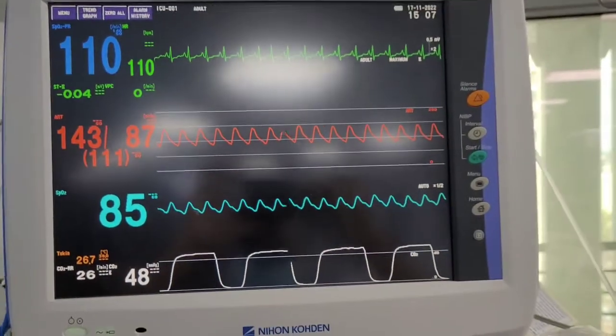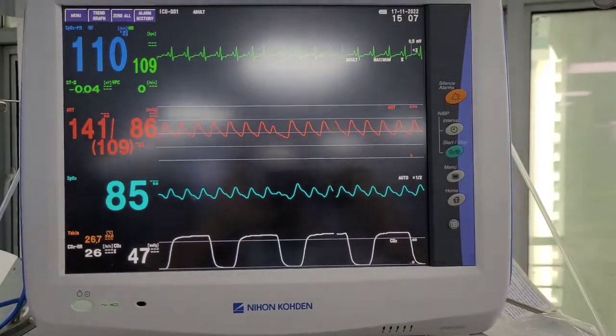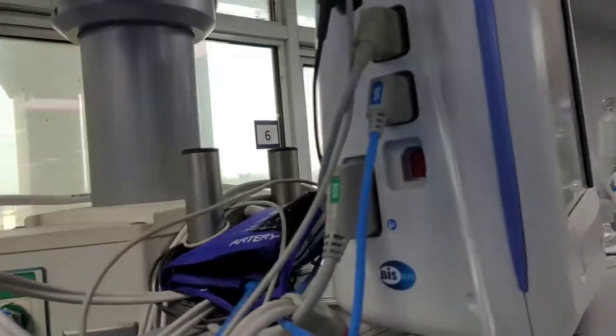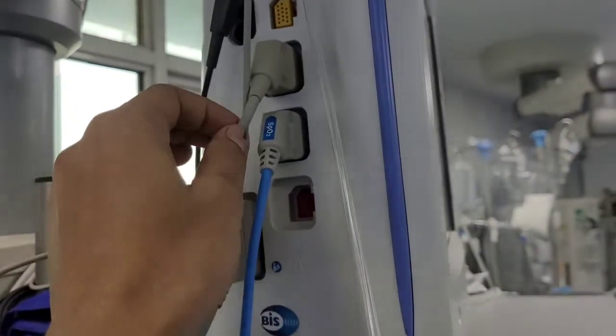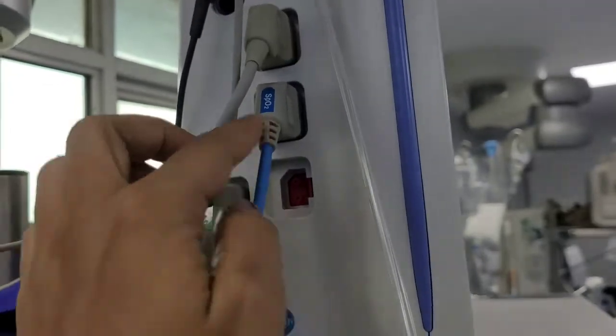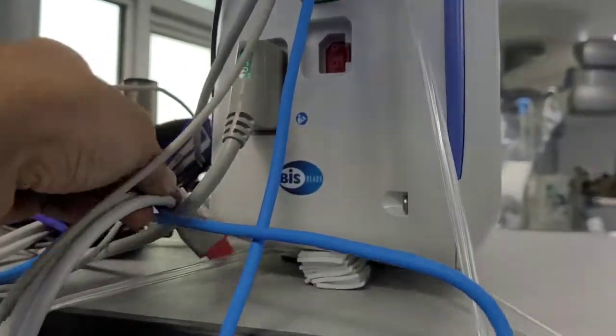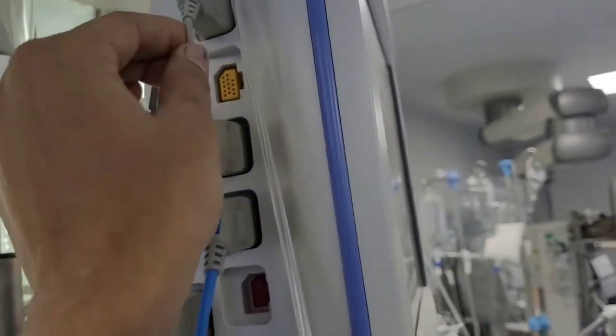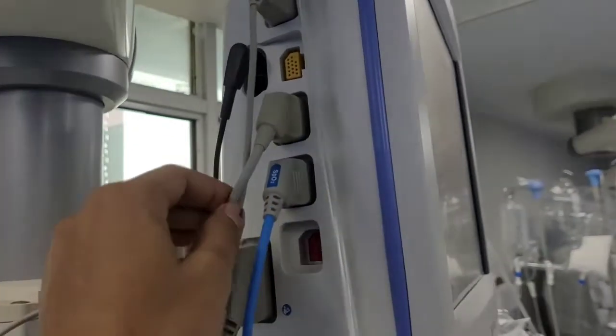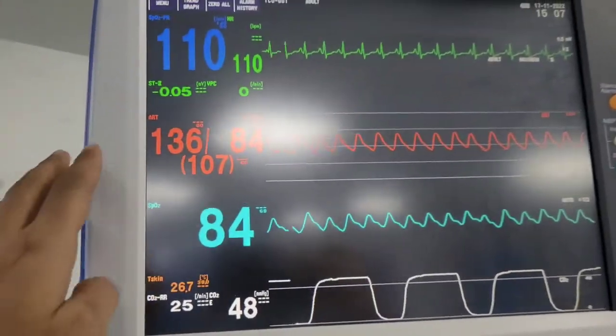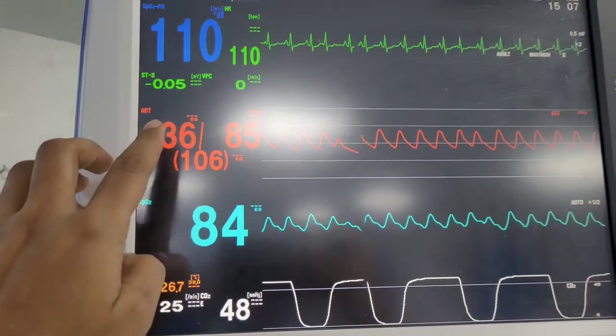This is a multipara monitor with Nihon Kohden. There are the ports and cables - this cable is for arterial monitoring, this is for SpO2, this is for ECG, this is for NIBP (non-invasive blood pressure), and this is for CO2. This cable here is for arterial monitoring.